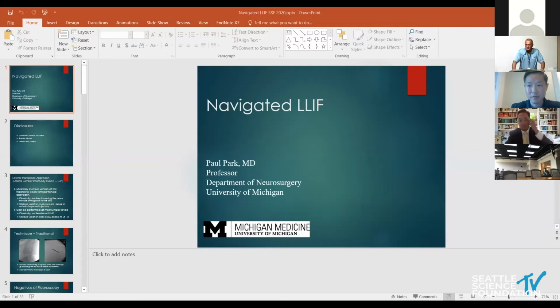So let me get something straight. And anybody who knows me, I'm a little bit slow on the uptake. So let's just go for a multi-level lumbar spine. Your referencing is off of 2 vertebrae, right? So your fiduciary markers are on 2 vertebrae. And you're going to change the alignment of the spine as you're distracting quite successfully. Do you have to re-reference the levels above them, because you're basically leaving kind of the 3 millimeter plus relative reference in a mobile spine, or a newly mobilized spine that you're changing alignment on? Or how do you handle that profound change of alignment in a multi-level case?